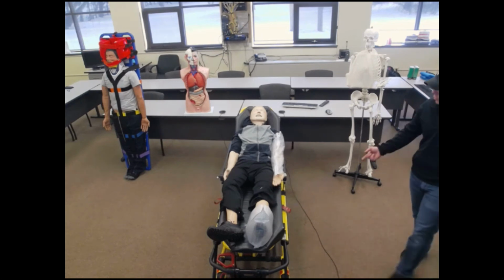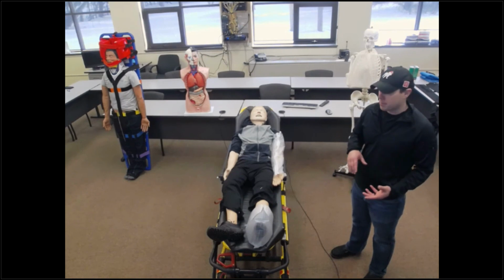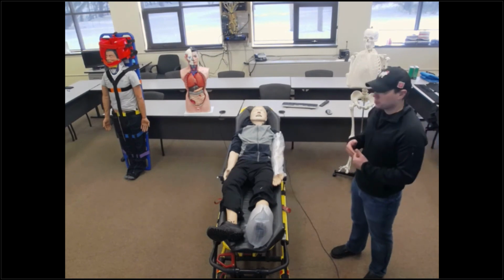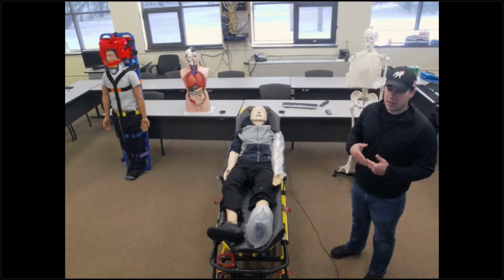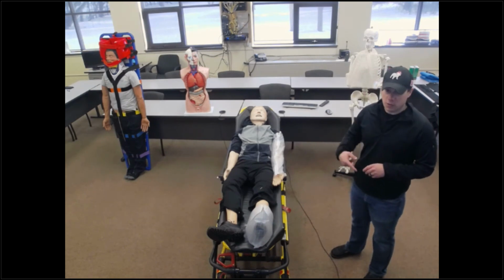So the splints will go ahead and go with the patient to the hospital. Oftentimes what will happen is they'll go ahead and remove those air splints, decontaminate them, and then place them in the EMS closet within the hospital setting so that you can reuse those.